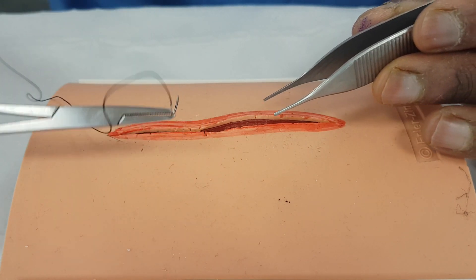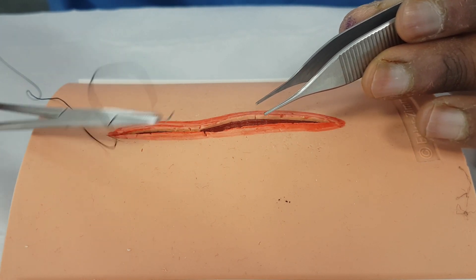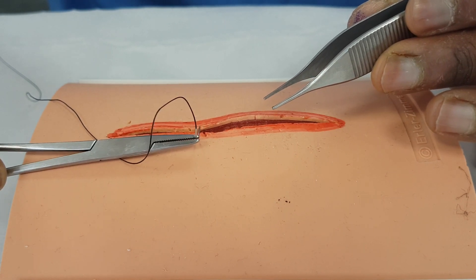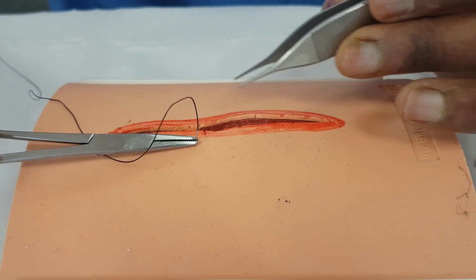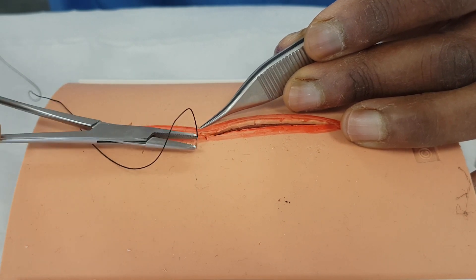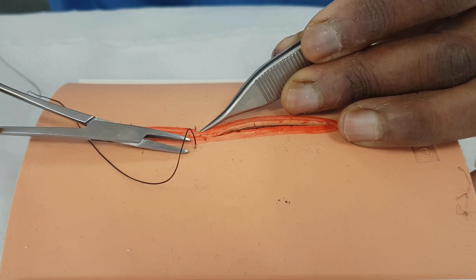You don't want to fight the needle — let the needle do the work. You're going at right angles to the skin; the point is actually going at right angles, not planar with it, not 45 degrees — it's going at 90 degrees to the wound. As it comes through, we let it come in 90 degrees on the other side, equidistant, the same distance away that we started.